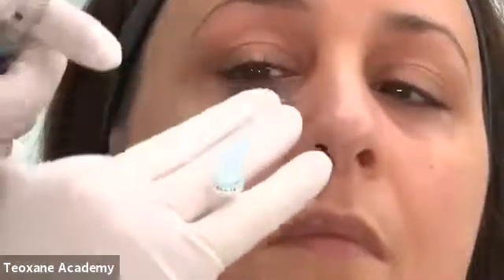So look, I use this little trick. I always have all my cannulas and needles in one hand, and I will use my cannula with the other hand. So I will turn a little bit like this. I will go with my needle just here and straight to the bone, because you want your cannula to go deep on the bone. This needle will also give me the direction. So as you can see here, my needle will give me the depth and the direction.